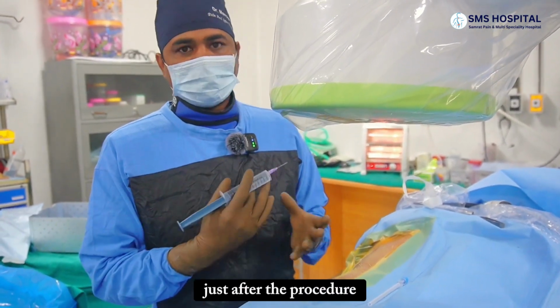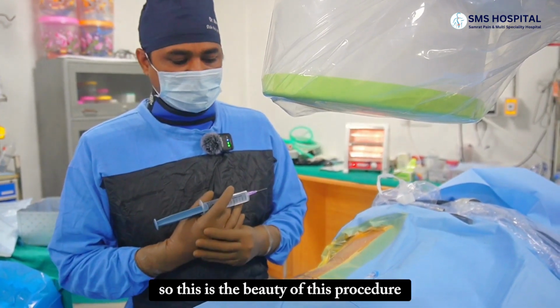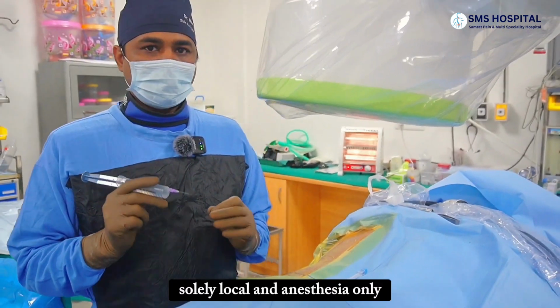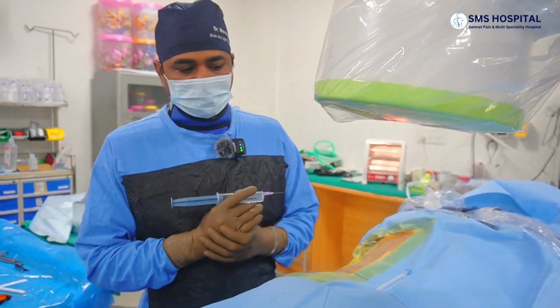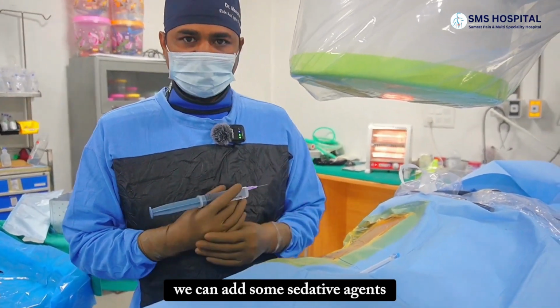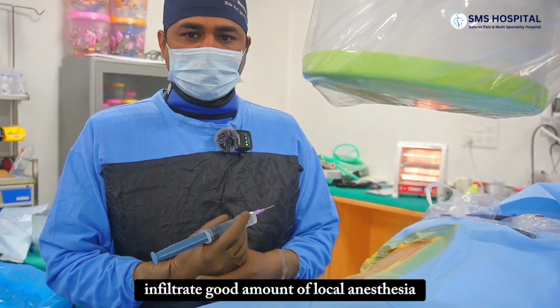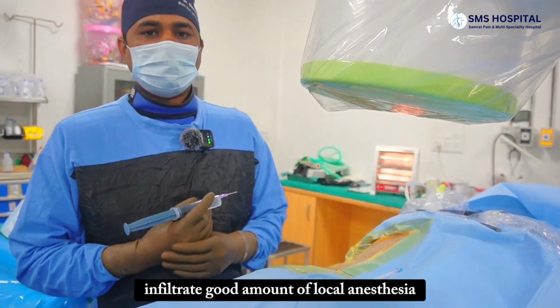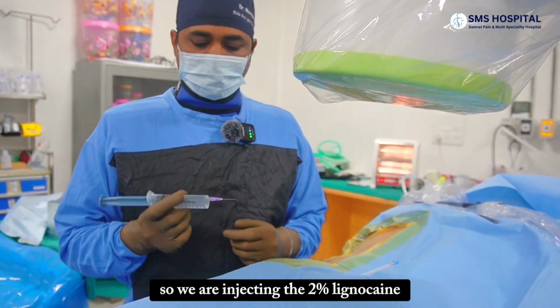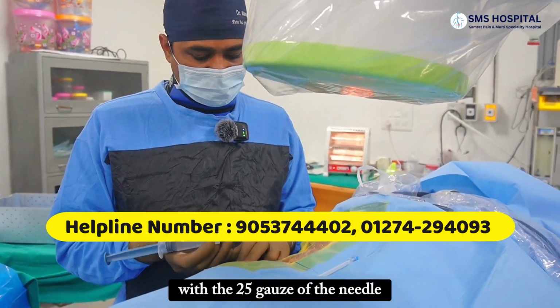Just after the procedure, the patient can walk and can go home. So this is the beauty of this procedure, and we will do it solely in local anesthesia. Sometimes if the patient is over apprehensive and anxious, we can add some sedative agents. Otherwise, if we infiltrate a good amount of local anesthesia, it can be carried out in local anesthesia only. So we are injecting 2% lignocaine with a 25 gauge needle.